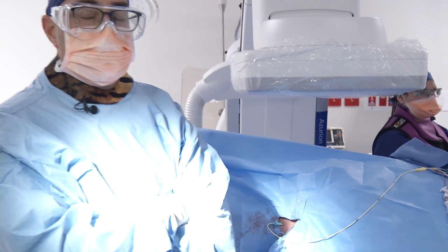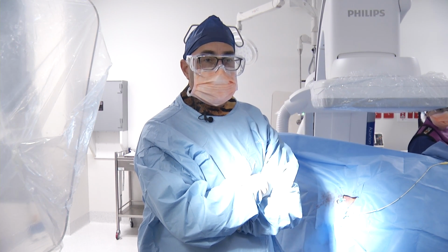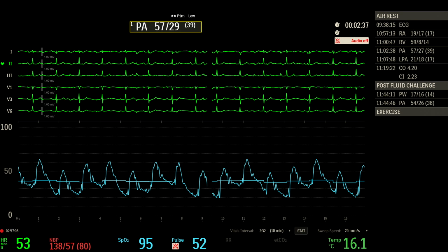The patient's starting to develop side effects of this dose, so we'll cease the infusion there and we'll take the pulmonary artery pressure trace and the mean pulmonary artery pressure and another wedge. As you can see, there's been no drop in the pulmonary artery pressure tracing, and therefore this patient is a non-vasoreactive patient.